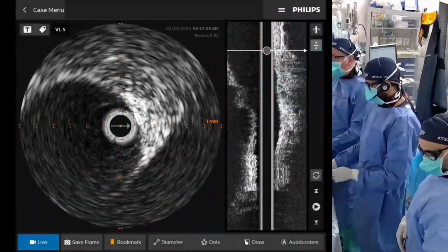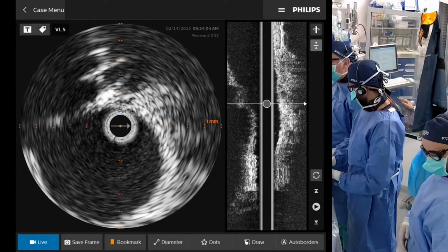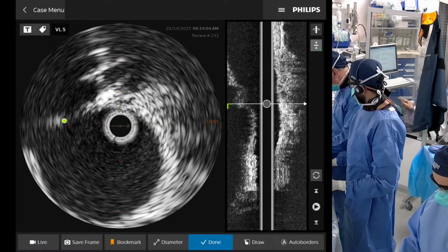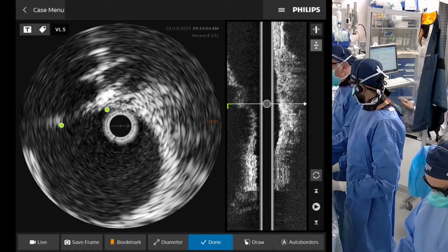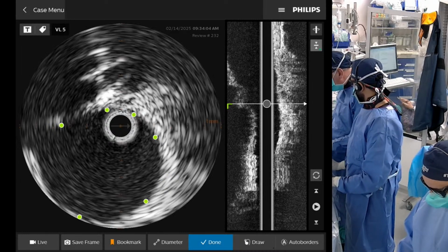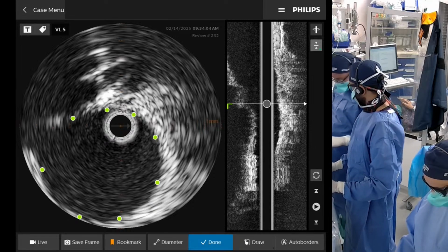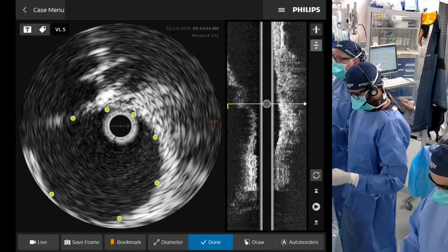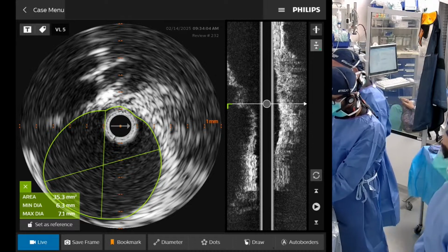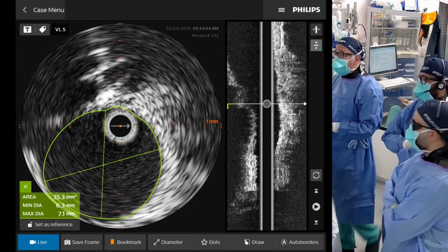It's an intraluminal process. So can we measure the distal renal artery? And Parag, we'll take that into consideration, what diameter we're getting, and we'll decide what kind of implant we're going to put based on that. By eye, Aaron, it looks a little bit bigger than the other accessory. I agree with you, by eye, and it's a really good question to have, which is what's the ideal implant for this kind of case? If I had to guess, Rob, this is probably going to be a 6 to 7, Parag. Yeah, and again, we can talk about what that should or would look like. So there, we're getting 6.3 times 7.